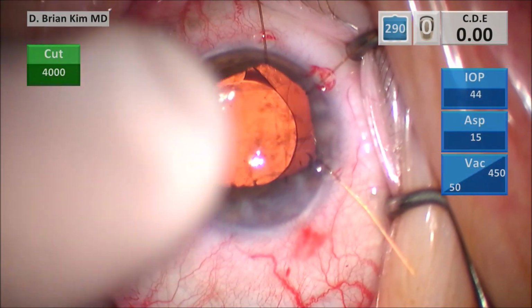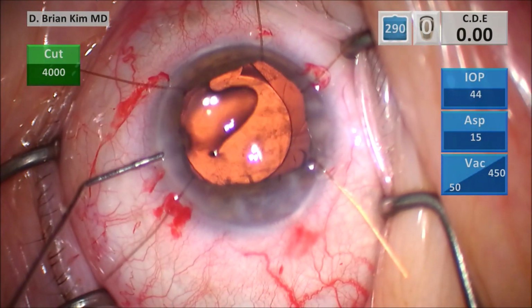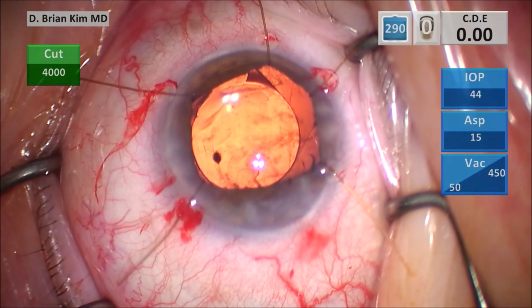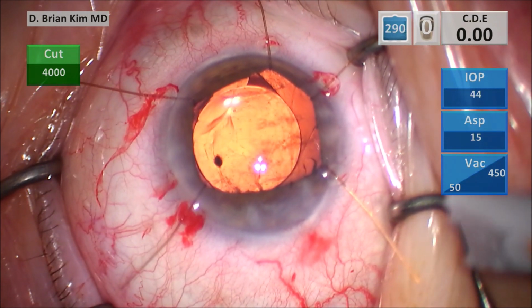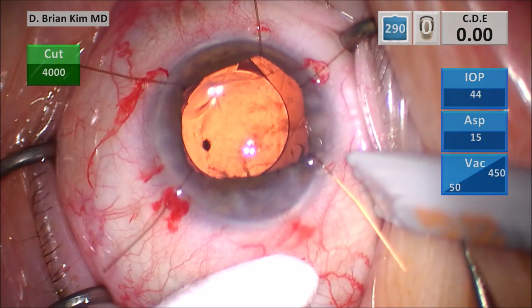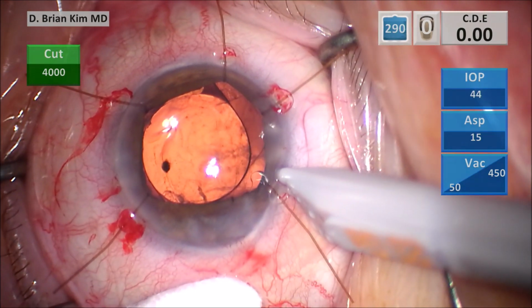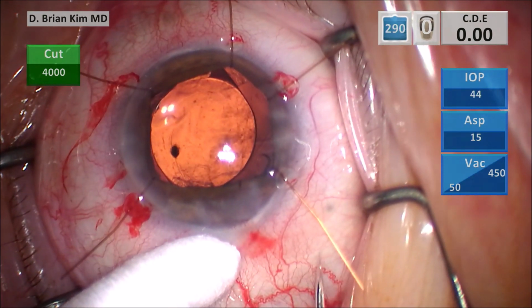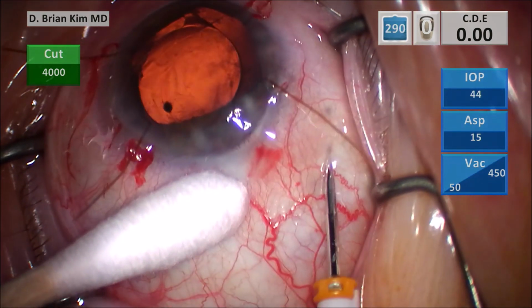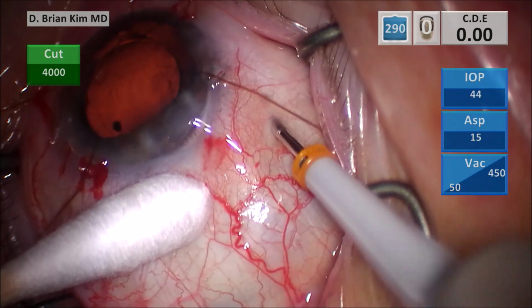And now, what am I going to do? If you have that much volume and you have vitreous coming forward, you have to perform vitrectomy. But you want to perform it pars plana. So I go ahead and indent and make a mark 4 millimeters posterior to the limbus with the trocar. And then I tunnel towards that trocar about 3 millimeters and then I dive down.